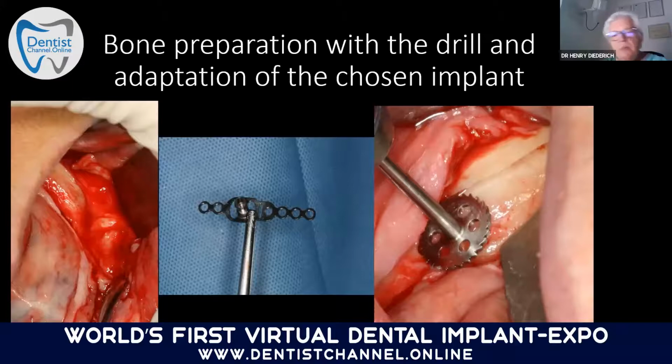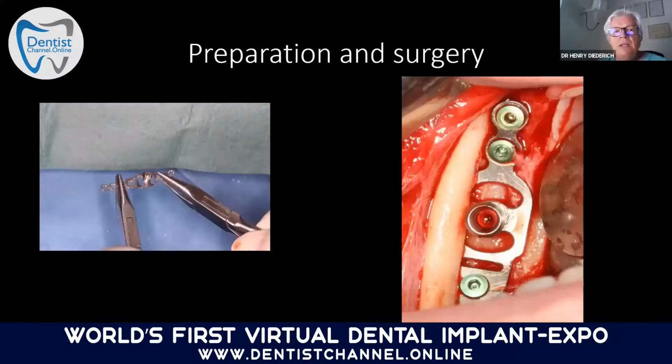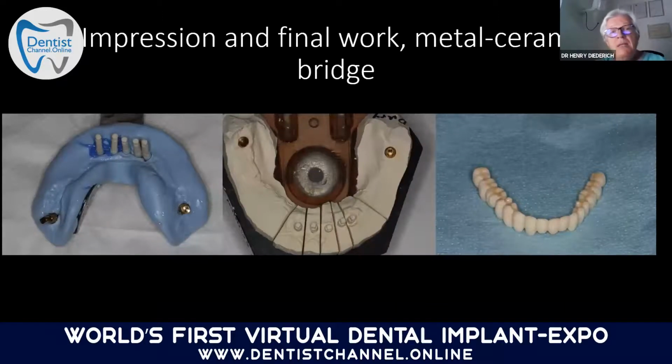Here we have to prepare the bone because, as I told earlier, we have to prepare a bed to put our implant, because our implant should be osseointegrated. And you see here how it is done. The implant is prepared and then it is put in the bone in order that the plate will be covered with bone, and bone will grow on it.